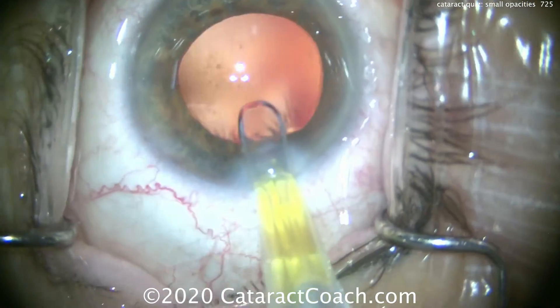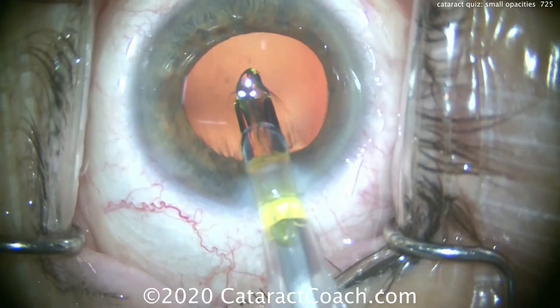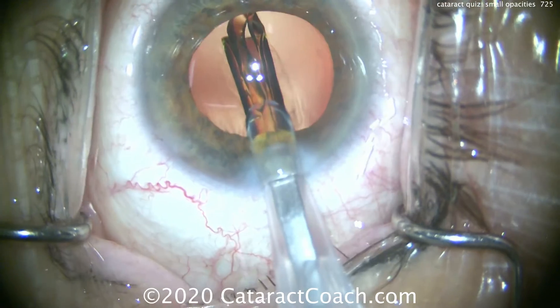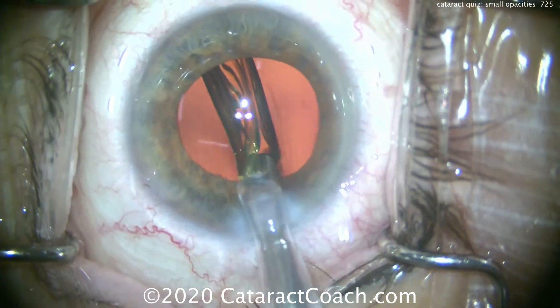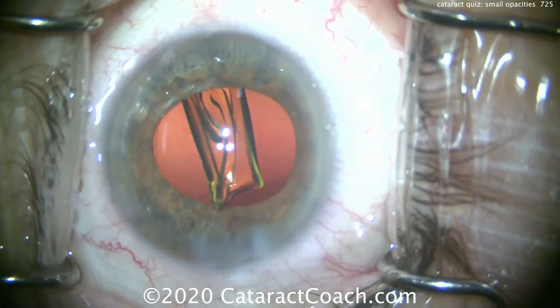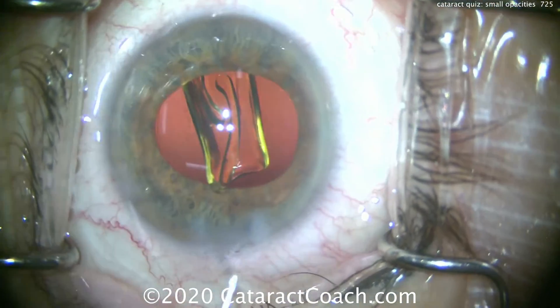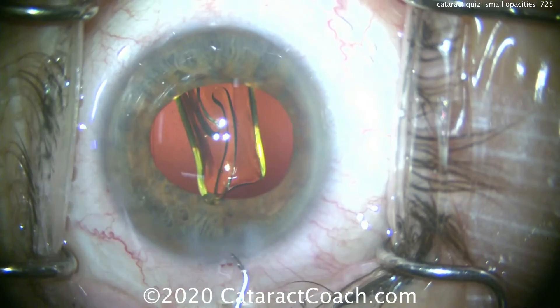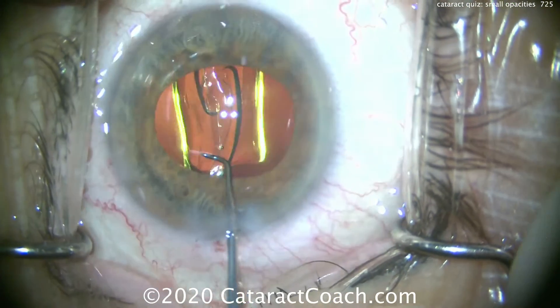We'll put the lens in the eye. This patient is getting a trifocal lens. There is good capsular support — there are just some areas where fluid was allowed to go between relatively lax zonular support structures.